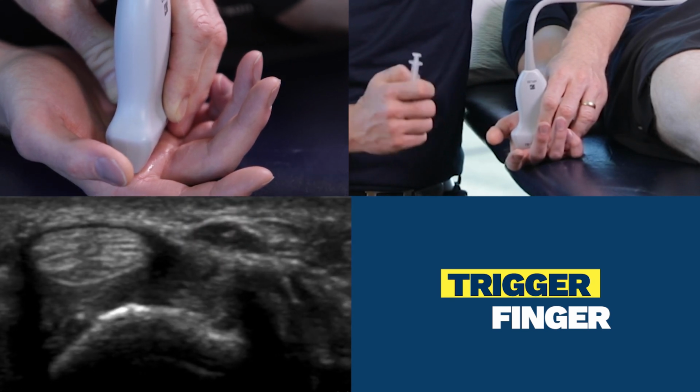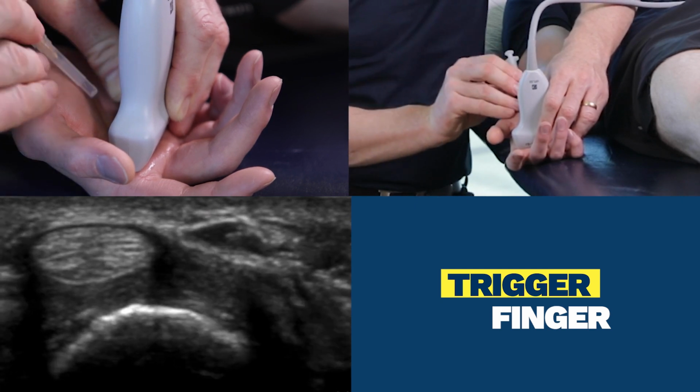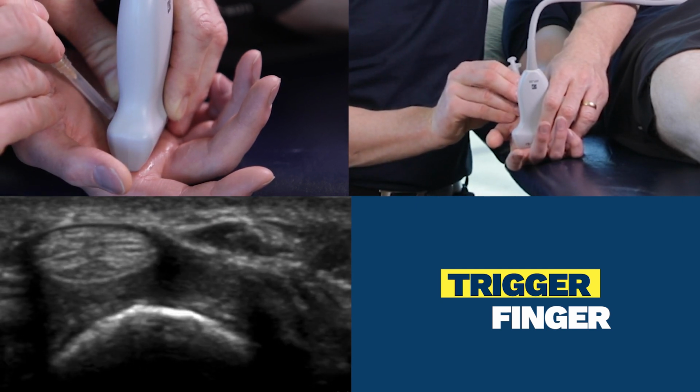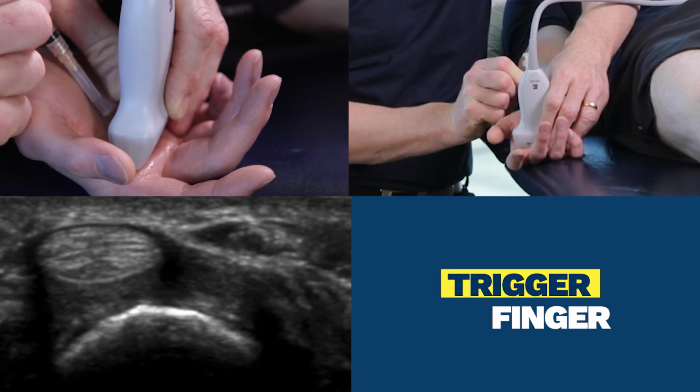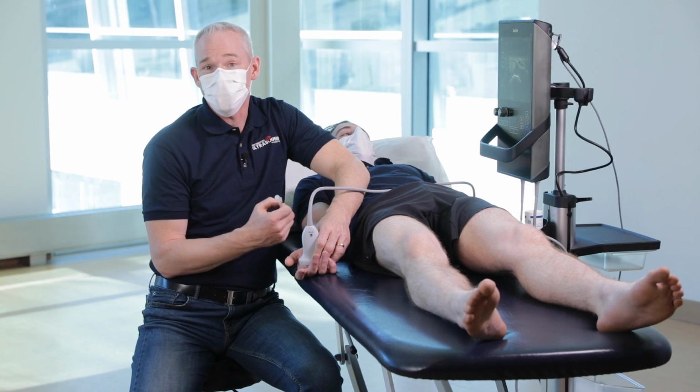My preferred method is to get the tendon slightly off the middle of the screen and place the needle immediately beside the tendon with the needle entry angle like so. And that's how I like to scan and inject a trigger finger.